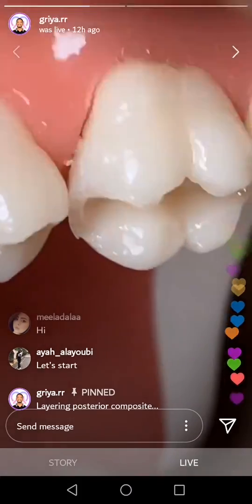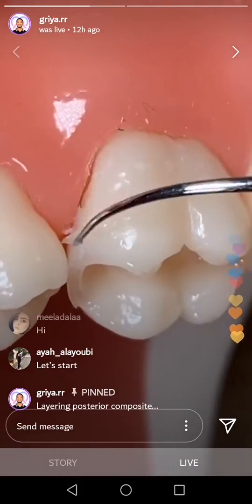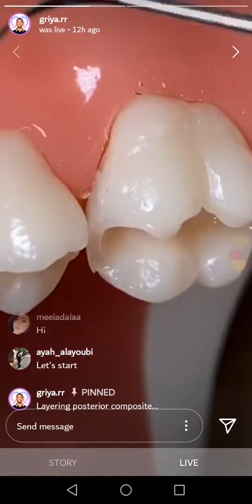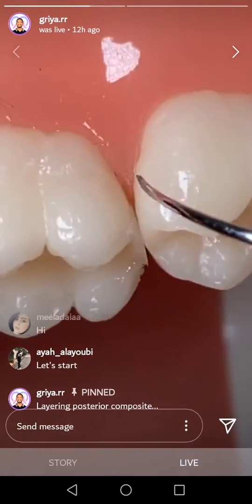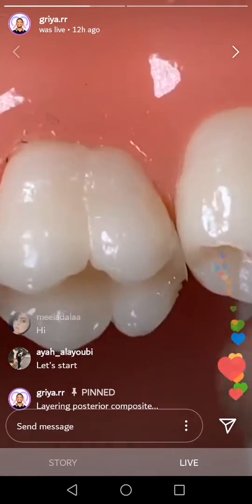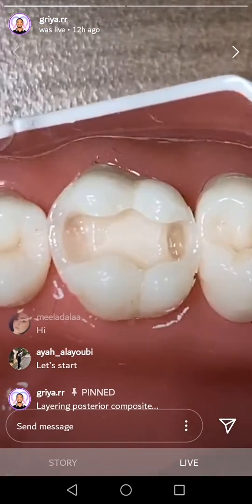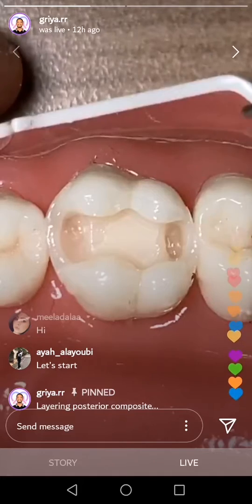Okay. This one, I will finishing. Okay, you can use blade also. Blade, remove this one. Got it? Okay, what's next? Okay, next you have a class 1 situation. Okay, it's class 1 situation, so it's easy for you.